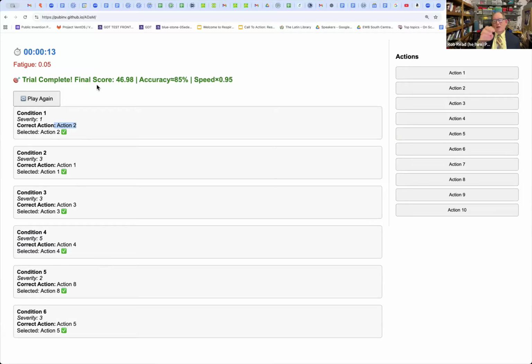Each alarm condition produces a different noise, and it is distracting the way an ICU can be distracting when there's a serious problem, and nurses and doctors are trying to think while all these alarms are screaming at them at the same time. That is part of what is called alarm fatigue. Now, this is not a good alarm system. This is a test bed for alarm systems, a mechanism for testing that.